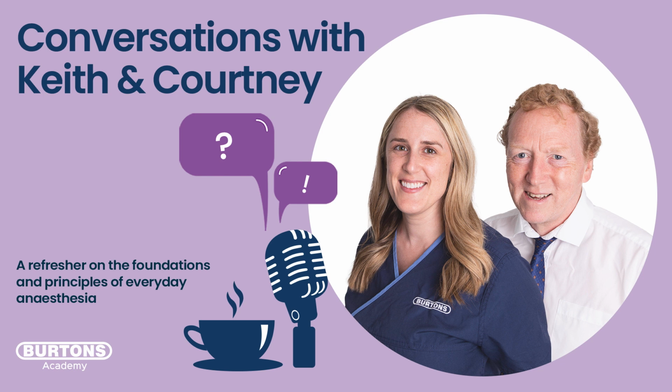And we set a volume. We can cycle that device in a number of ways: pressure cycling, volume cycling, time cycling. But basically, it's called volume control ventilation. We're going to put a volume into the patient. So there we are. We now have a volume that we're going to set on this machine.